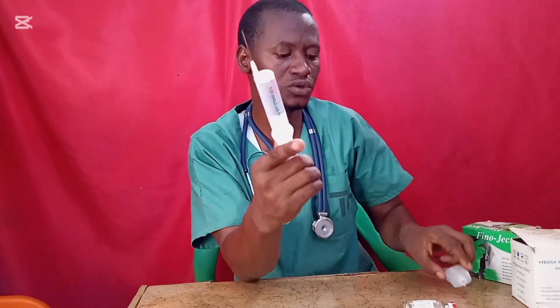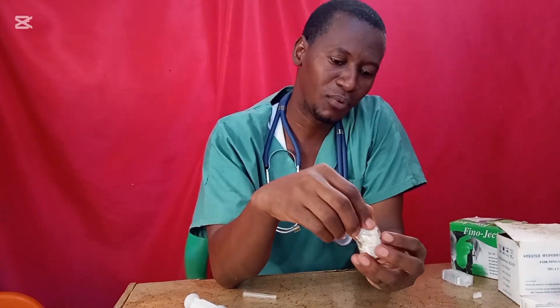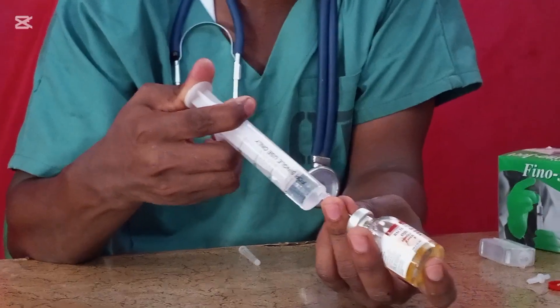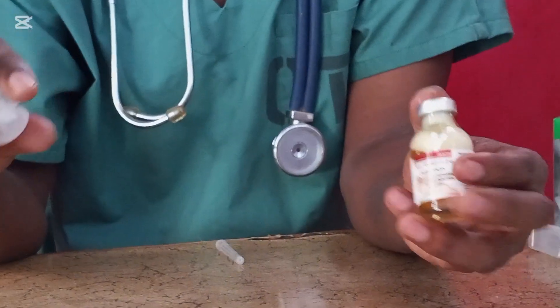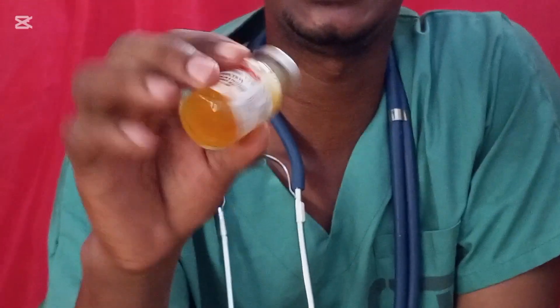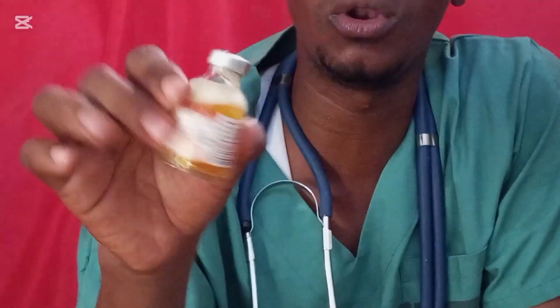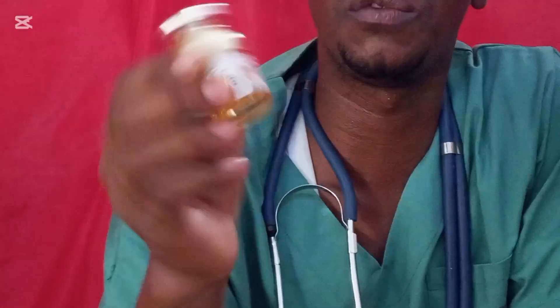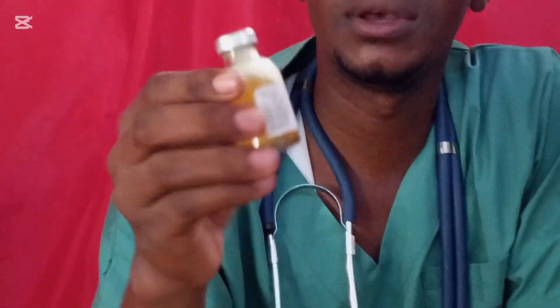After withdrawing the water for injection, remove the air bubble. Then open the cap of the augmentin vial, insert the needle deep into the vial, and transfer all of the sterile water for injection into the vial. Remove the needle and start shaking it gently until the solution is clear with no white or visible particles. This is how you dilute IV augmentin — amoxicillin and potassium clavulanate 1.2 gram.